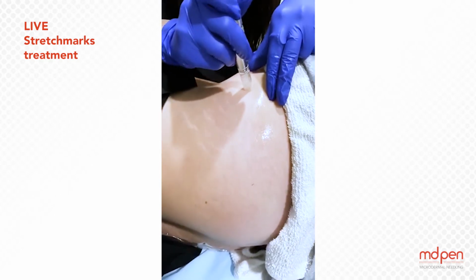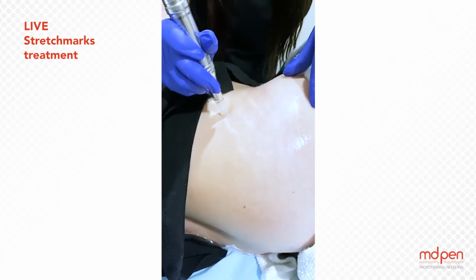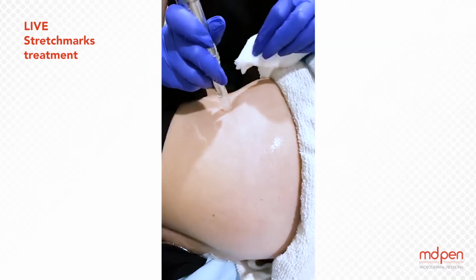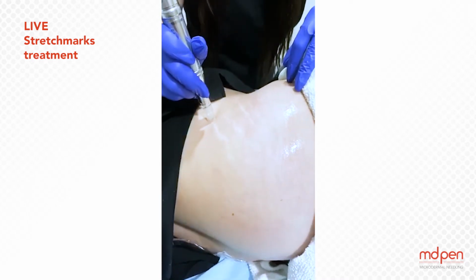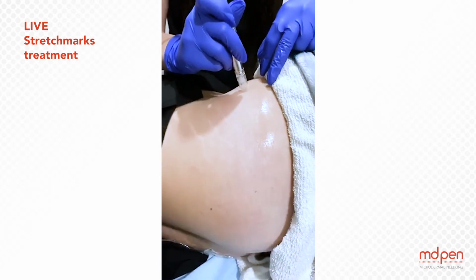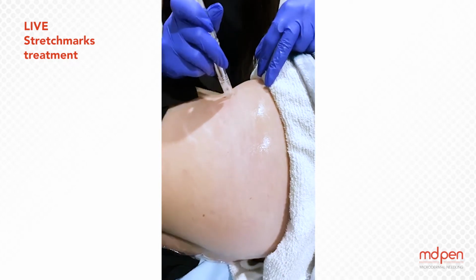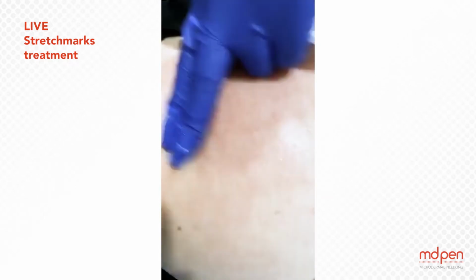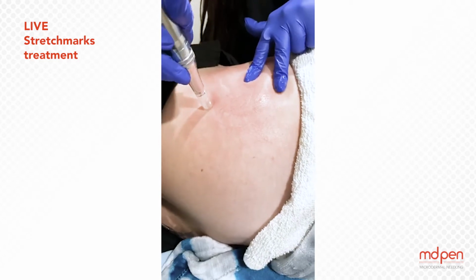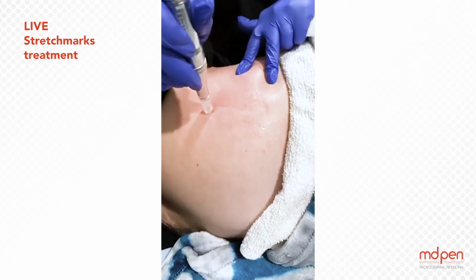So you don't want to treat the stretch mark as just a line. We're treating it as a grid, as a whole area. And my speed is about 1 second per square inch. Topically, I believe tretinoin is the only thing that's been proven to help with stretch marks, but not everyone wants to use that, and that alone is not going to create the collagen that we need to fill in.